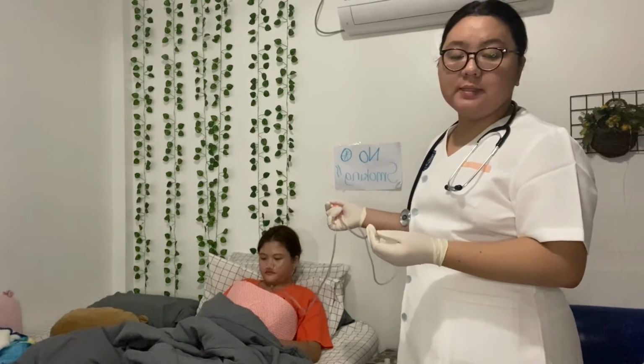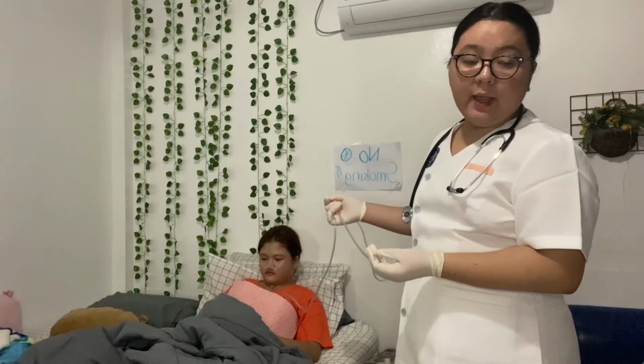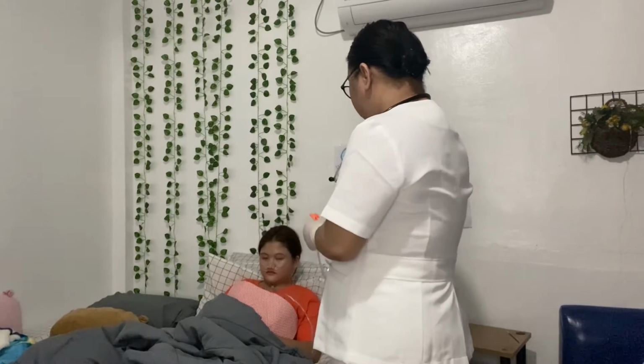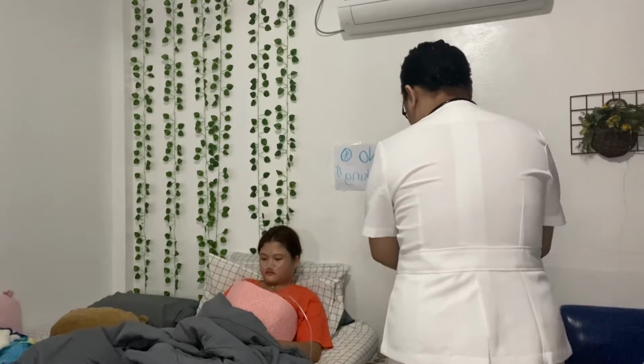And then replace oxygen delivery device, encourage the patient to breathe, rinse catheter and connecting tubing with NSS until clear and continuous suction. So I'm going to rinse the catheter.